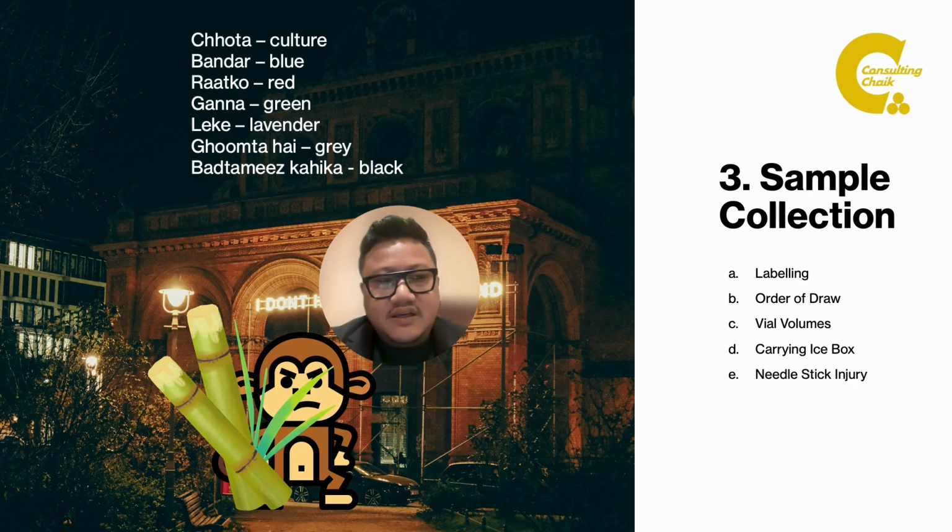So you can see chota as in culture, बंदर blue, रात को red, गन्ना green, लेके lavender, घूमता है grey, बदतमीज कहीं का black. So this is the order of draw that we follow.